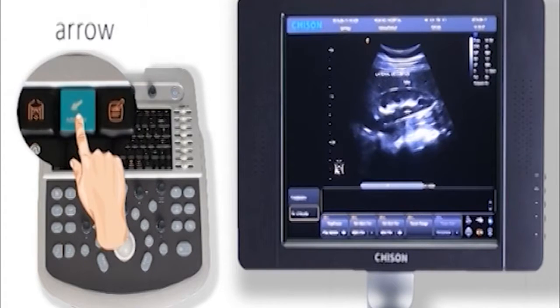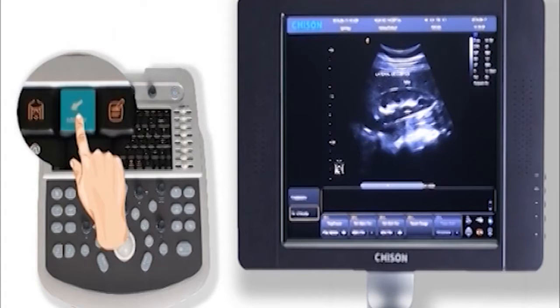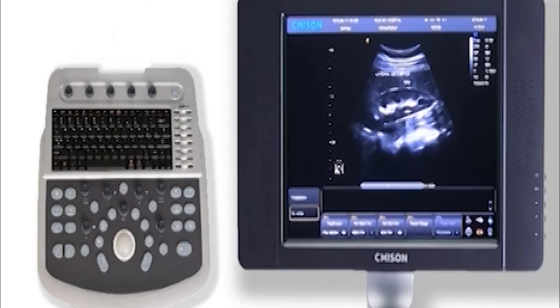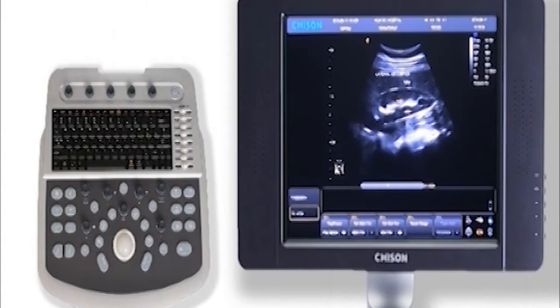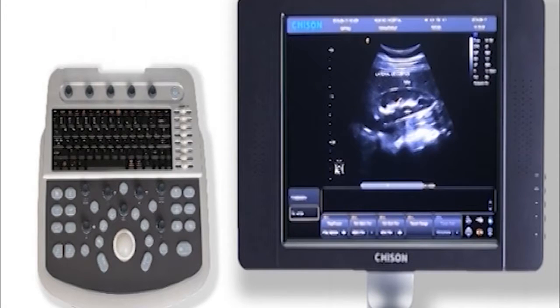This key is for arrow. Rotate the angle knob and you can change the direction of the arrow.